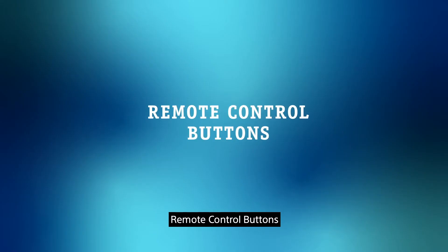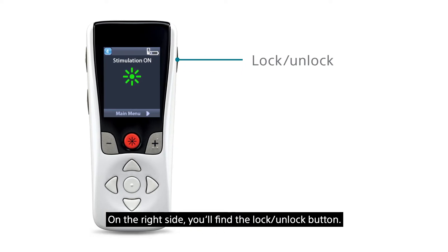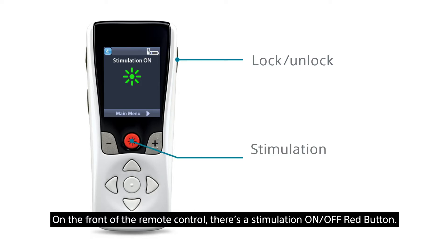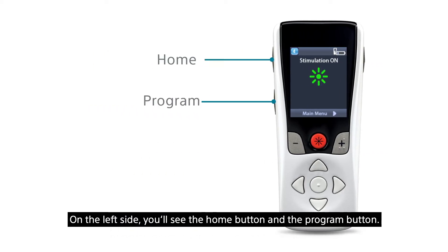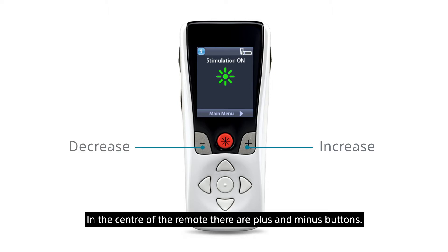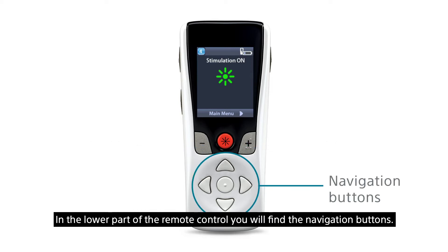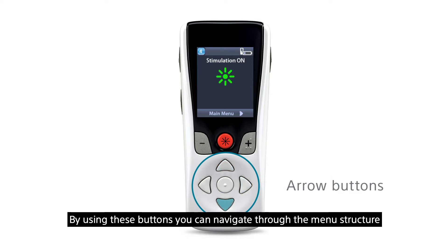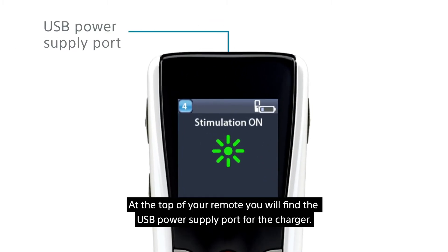Before we show you how to use the remote control, let's start by explaining the various buttons. On the right side you'll find the lock/unlock button. On the front of the remote control there's a stimulation on/off red button. On the left side you'll see the home button and the program button. In the center of the remote there are plus and minus buttons, which can be used to decrease or increase your stimulation. In the lower part of the remote control you will find the navigation buttons. Using these buttons you can navigate through the menu structure and confirm your selection by pressing the center round enter button. At the top of your remote you will find the USB power supply port for the charger.